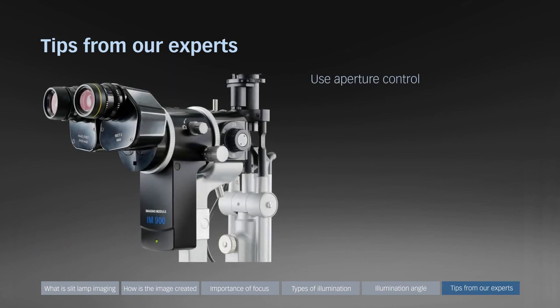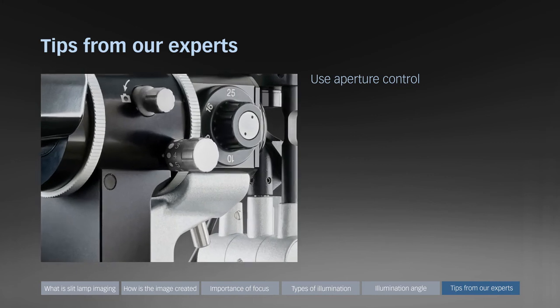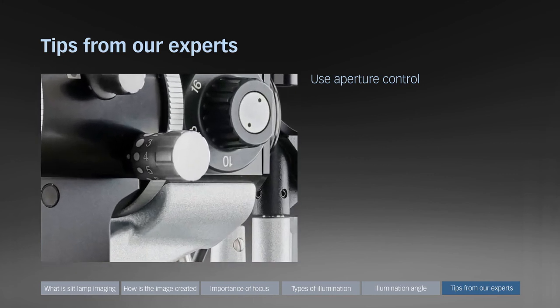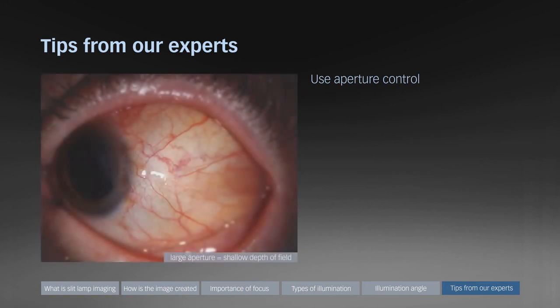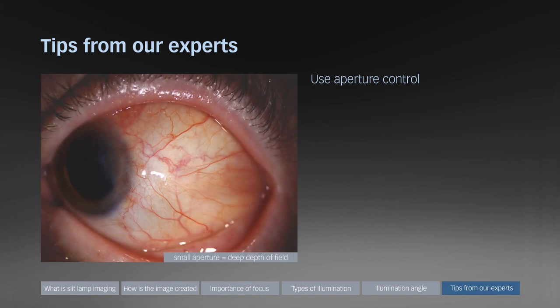Use aperture control. The Haag-Streit IM900 Imaging module provides aperture control. Use a large aperture if little light is available and a small aperture if deep depth of field is required. Here an example of an image with shallow depth of field. Here the same eye with deep depth of field.